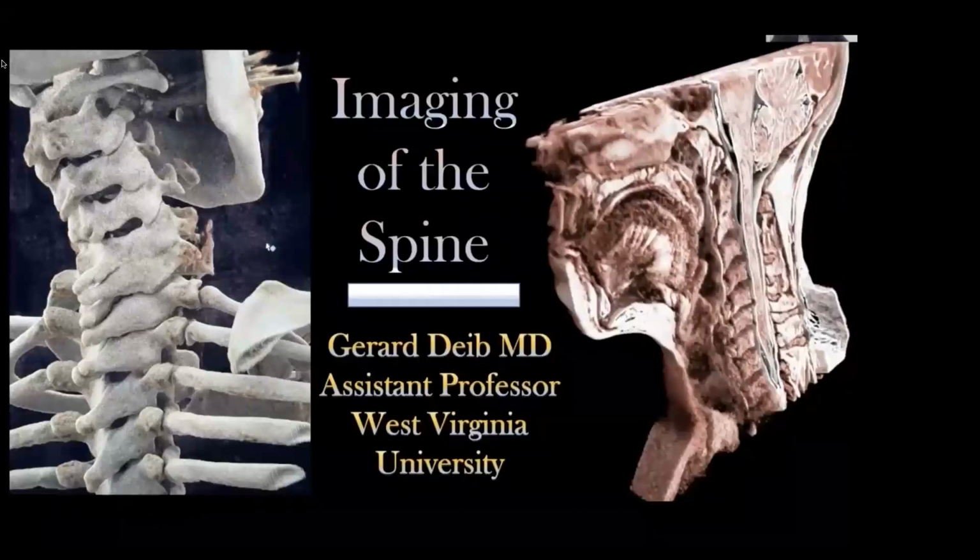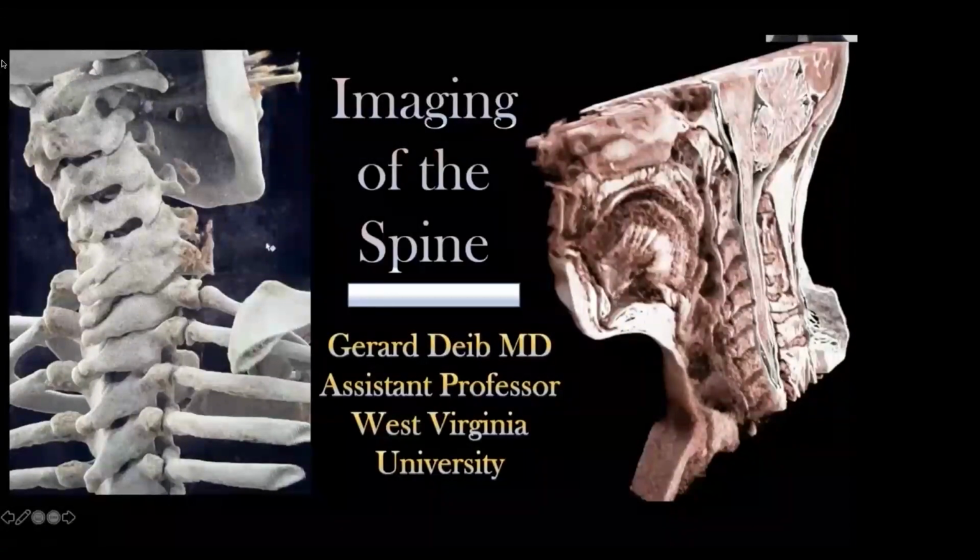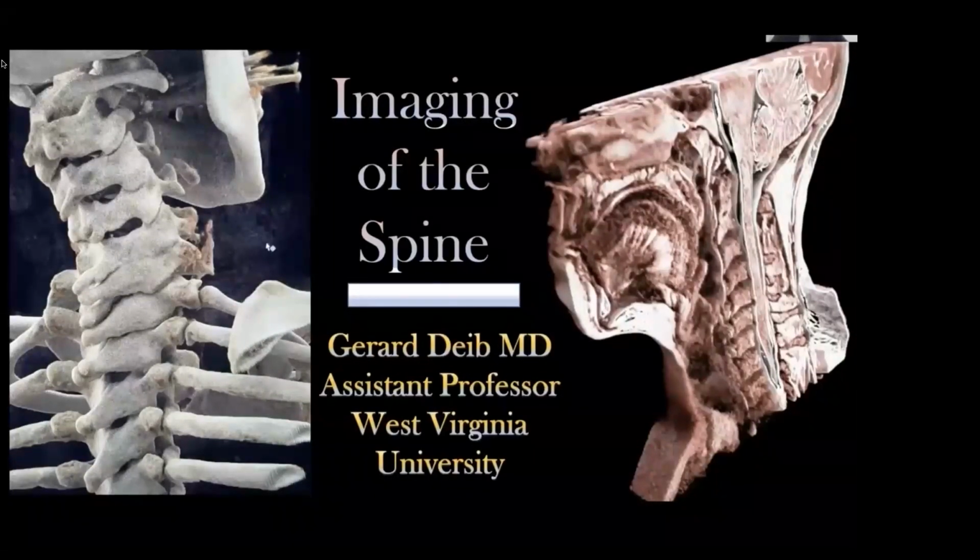Obviously, you guys have been through a comprehensive anatomy course, but here we're just going to focus in on some particular areas where some of the imaging modalities may be particularly helpful to relay the complexities and intricacies of those anatomic details, and to show the sort of technology that we have available in terms of our ability to show these areas and pathologies to the best of our ability.